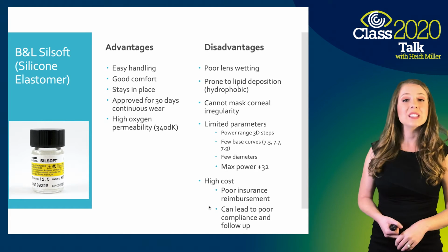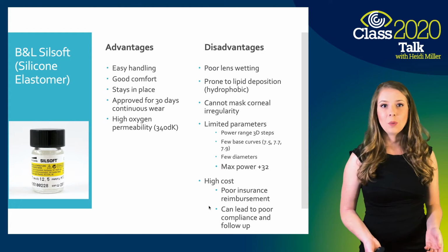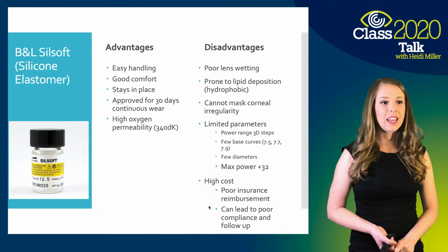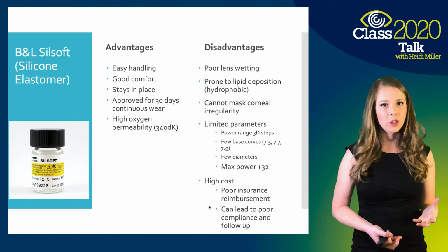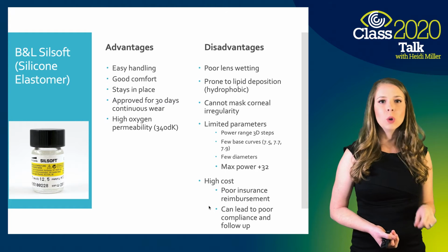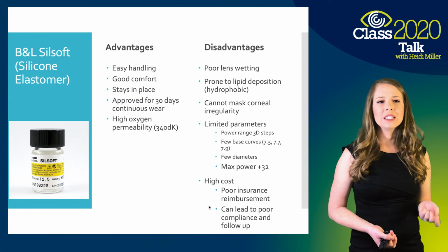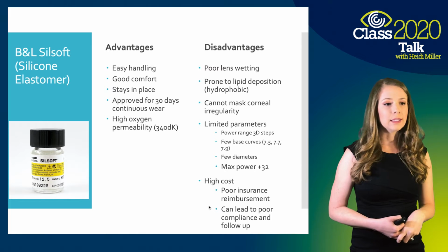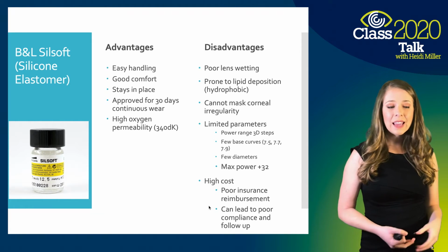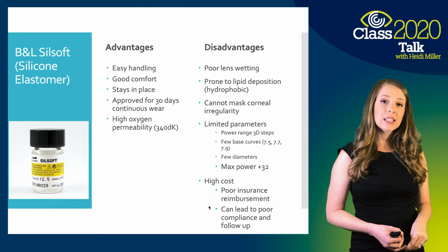Now, when we take a look at SilSoft, this is one of the most common lenses that we use for treating aphakic patients. It's a great lens for handling. I'm sure we've all handled one and noticed the button is very easy to hold on to. When you're putting the lens in and out, it's very easy to grab onto that button in the center of the lens. It's got good comfort for patients, stays in place, and it's approved for 30 days continuous wear.